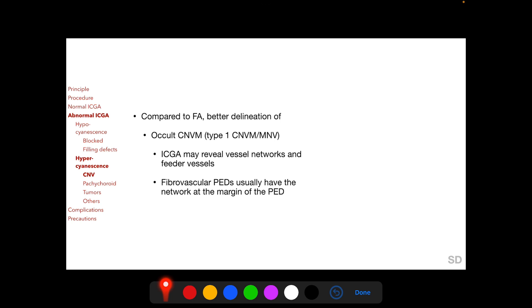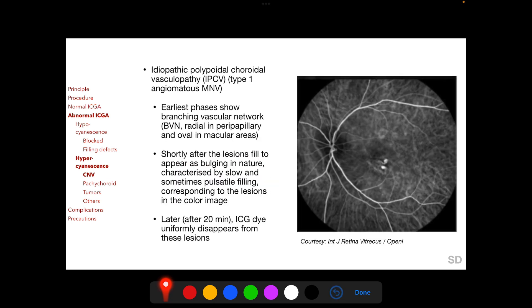There are three situations of macular or choroidal neovascularization where ICGA can delineate the lesion better compared to fluorescein angiography. First is the occult choroidal neovascular membrane, also called type 1 choroidal neovascular membrane or type 1 macular neovascularization, which occurs between the retinal pigment epithelium and Bruch's membrane — ICGA may reveal vessel networks and feeder vessels. Second is idiopathic polypoidal choroidal vasculopathy, or type 1 angiomatous macular neovascularization, in which the earliest phases show a branching vascular network (BVN), with slow and sometimes pulsatile filling corresponding to orange-colored lesions in the color image.